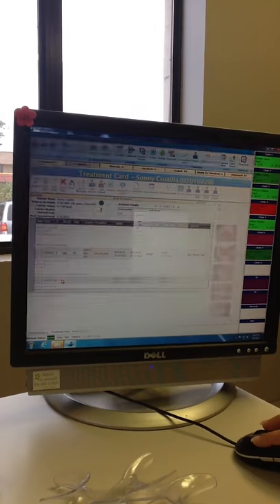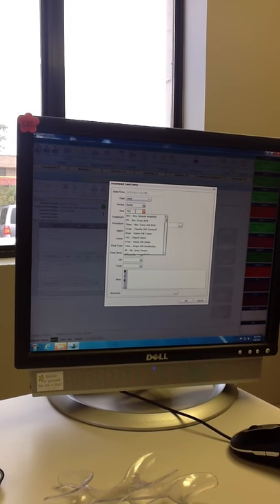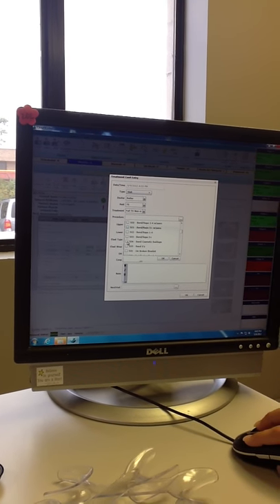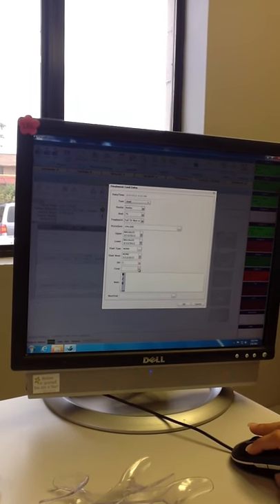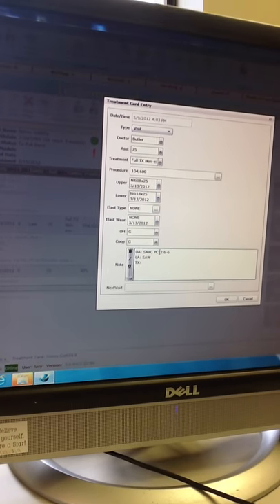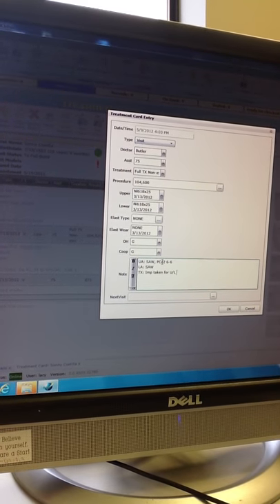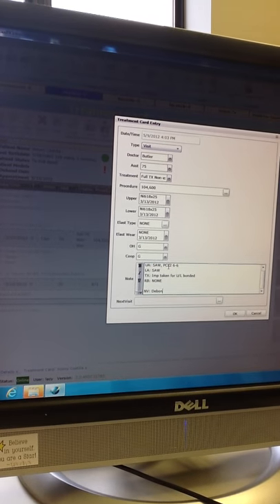This should be the end of your appointment — go ahead and chart. Just making sure that nothing is left blank, being very specific in her notations. She's specifying that the patient is not wearing rubber bands.